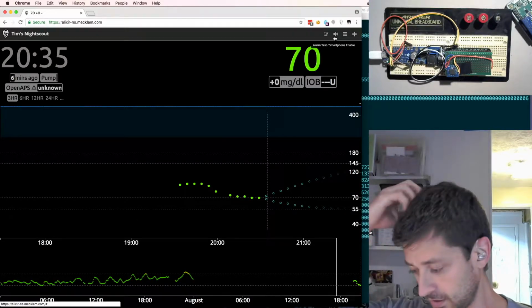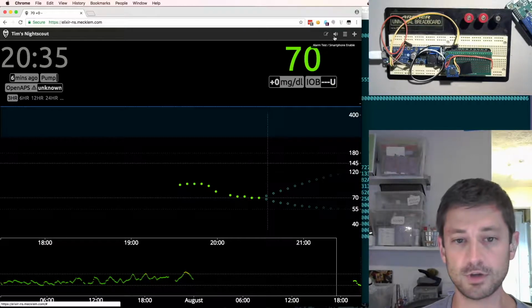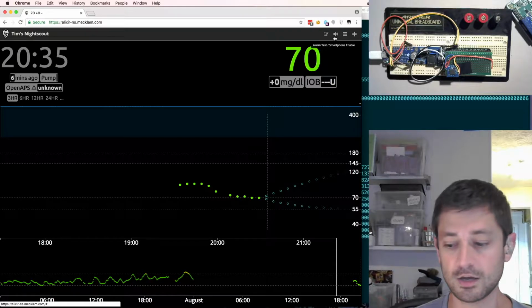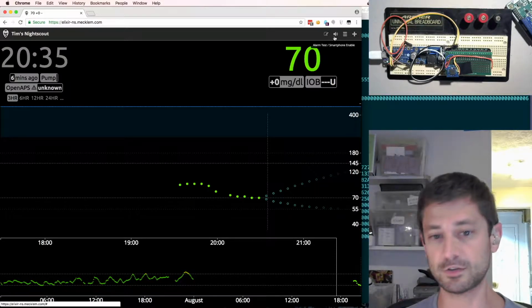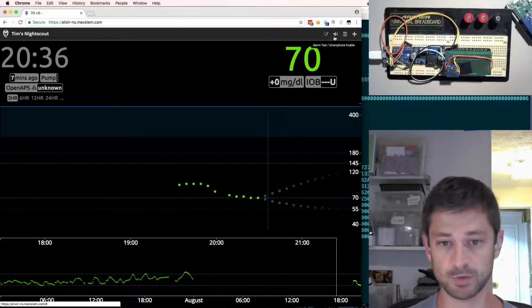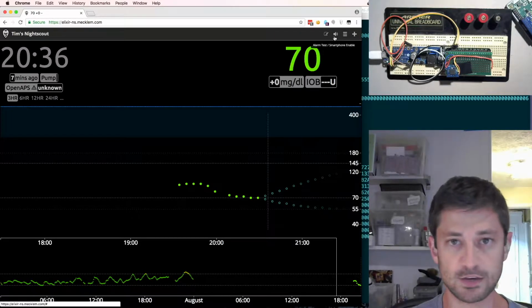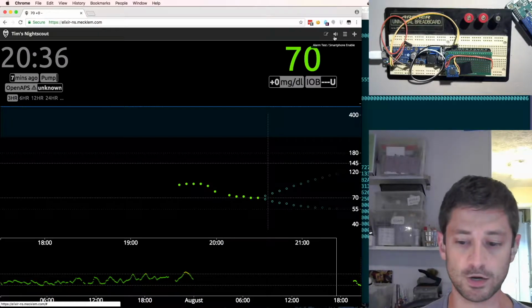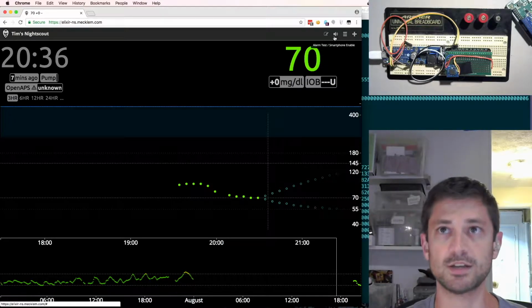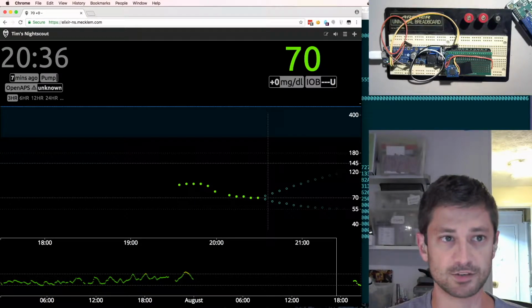And what I'd like to do, and I know is possible, is that the insulin pump actually has a command that you can run to query from the pump itself what the date and time is that it thinks that it is. Generally speaking, it's probably better to be able to use NTP and use the internet to set the time on the computer, so that if there's anything off between the pump and what Night Scout thinks, that we can actually identify that. I don't want to get that sophisticated with it yet. I really just want to handle this situation where the pump is the authoritative time because there is no NTP server available to give us a time. And so I'm going to kind of dig into that problem space just a little bit and try to understand what it's going to take to query the pump and ask it what time of day it is.